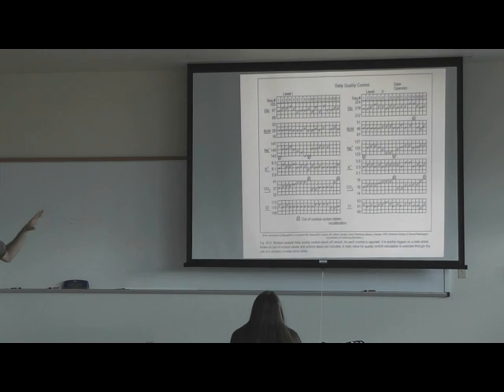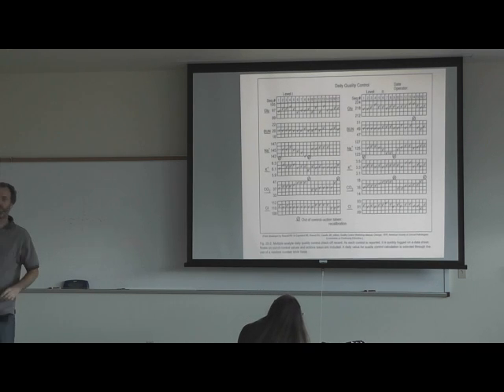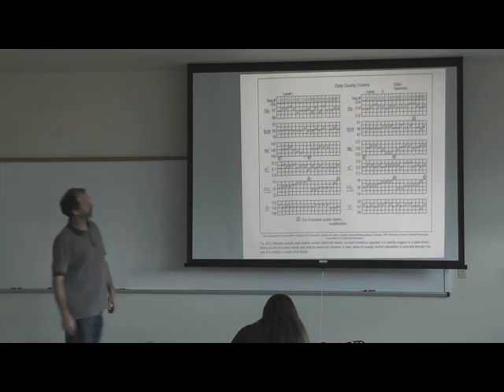But apparently, back before computers in a clinical lab, they would just tack these up on the wall every day, and then you could have a visual representation of where all the runs are, so you can clearly see when you're getting a gradual, not a shift, but what's it called? Trending in one direction or another, and you're getting some skewing. But these all look okay except for those out-of-control actions.